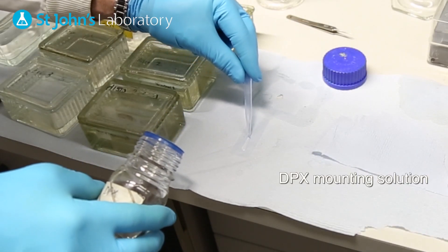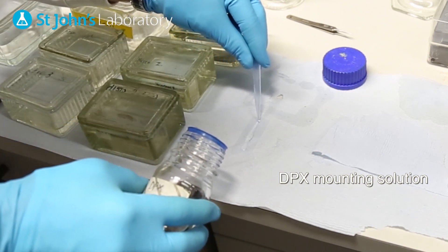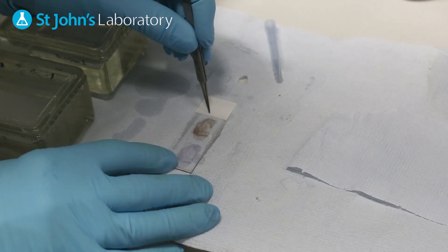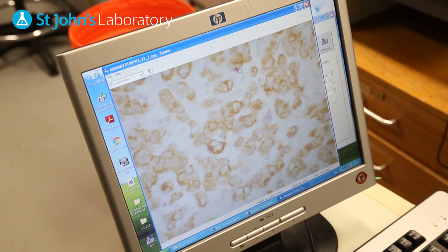When you reach the mounting stage, apply the solution to cover the slide, and then holding it at a 45 degree angle, allow the solution to spread along the edge of the slide. Let go and allow the medium to spread, ensuring there are no air bubbles.